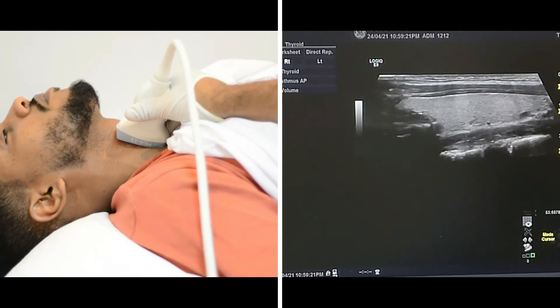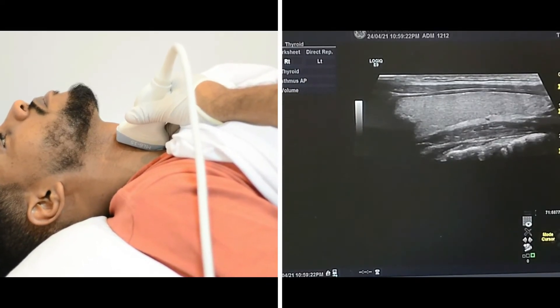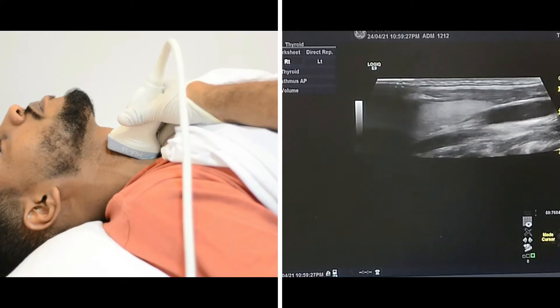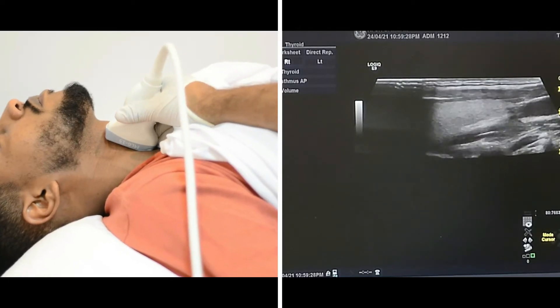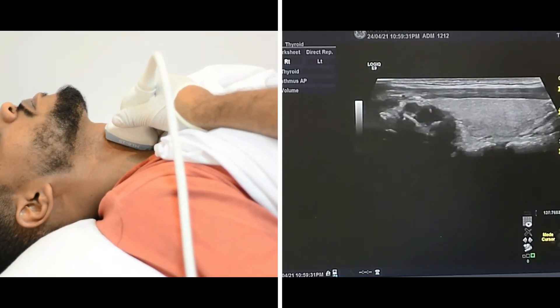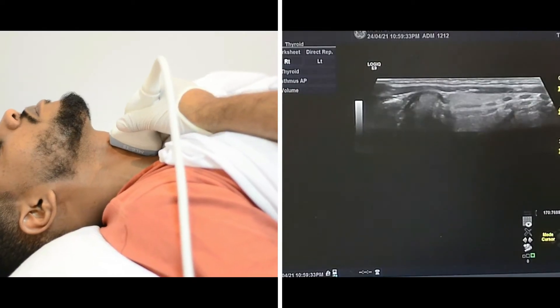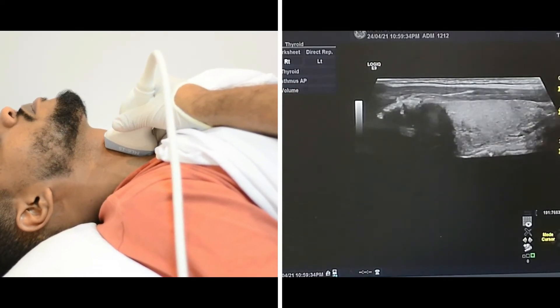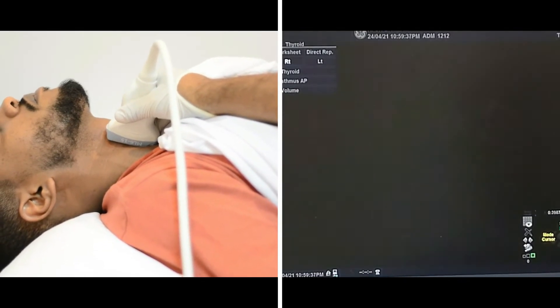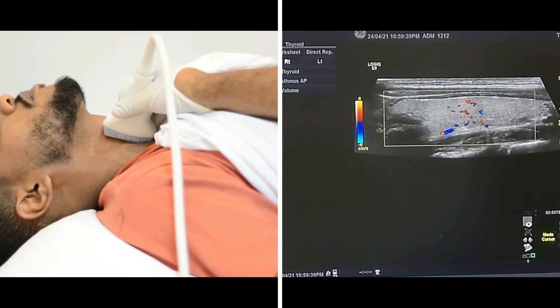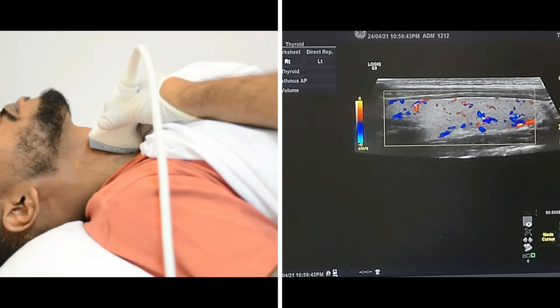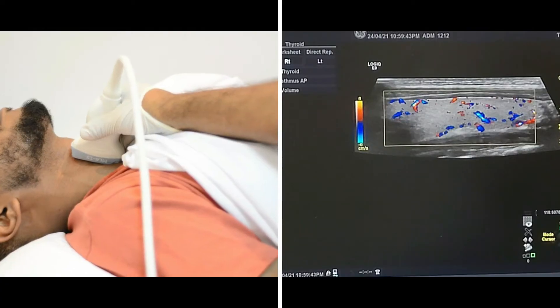After that, scan the thyroid in the sagittal plane, trying to cover the whole gland looking for any abnormality that you could pick up. Now we apply the color box to check the vascularity, and this will help us in evaluating many abnormalities.